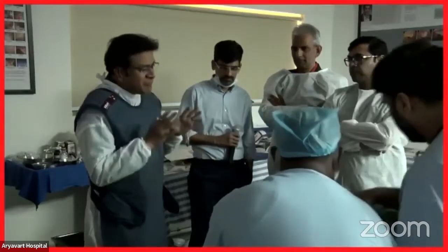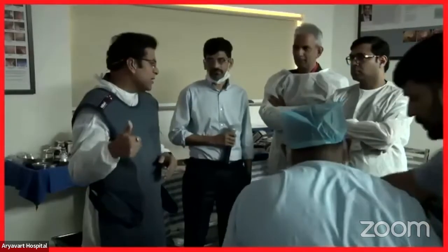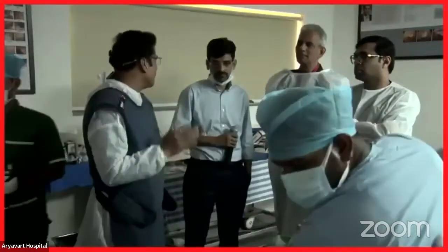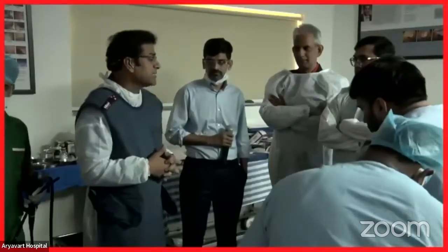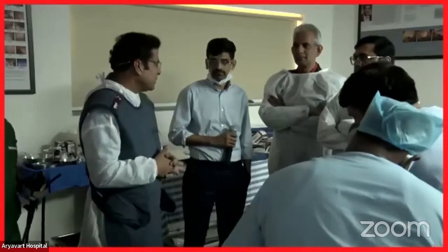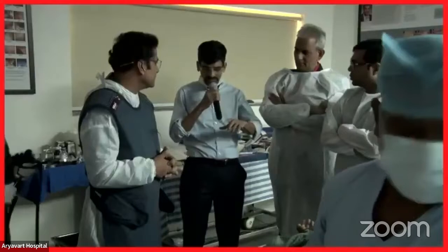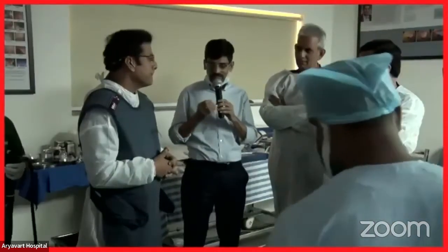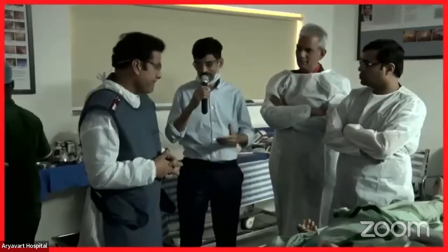The worst complication that can happen is the stent with one end in the jejunum and the other end in the peritoneum. Then the patient is straight away a surgical candidate, and if you are not able to offer surgery, the patient succumbs. I feel the most crucial part is where you pierce the stomach and the jejunum, and it has to happen so quickly that your jejunum doesn't run away from you. Any specific tips you have to offer in that respect?